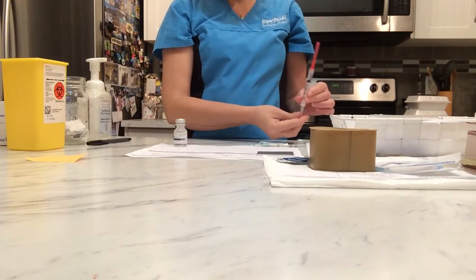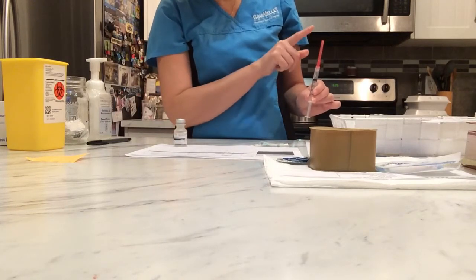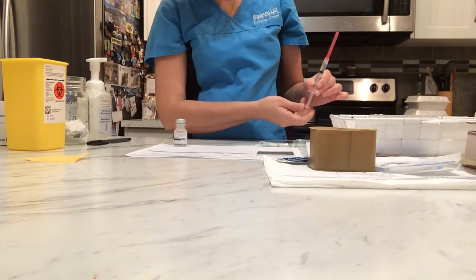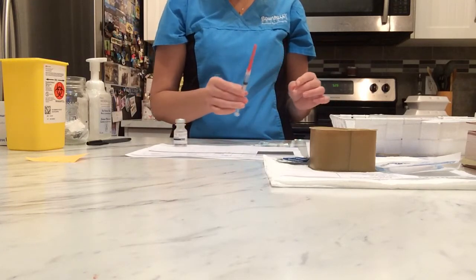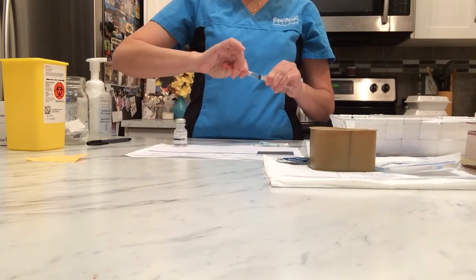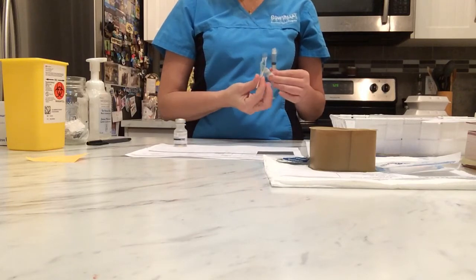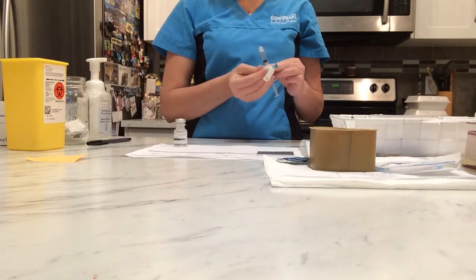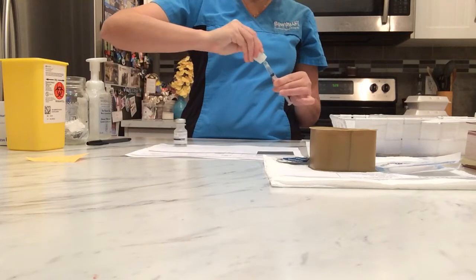So I will pull the plunger out. I need all the medication that I have here to prime my next. Okay. I will change needles now, and I discard it in the sharps container. For the purpose of the video, some of my supplies have already been opened since I've been practicing.